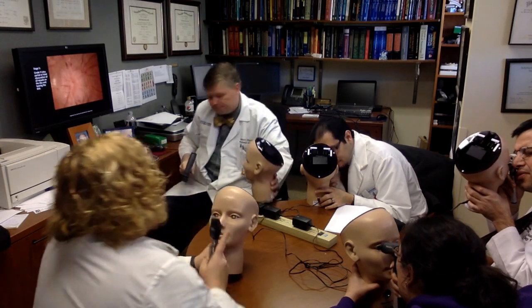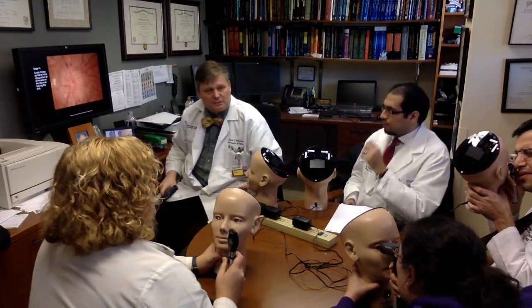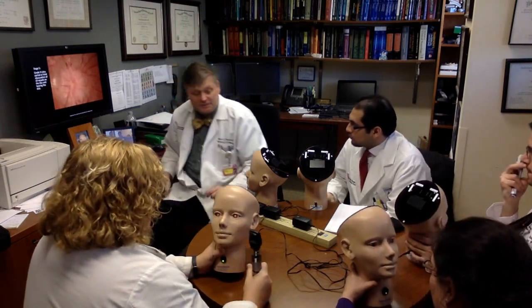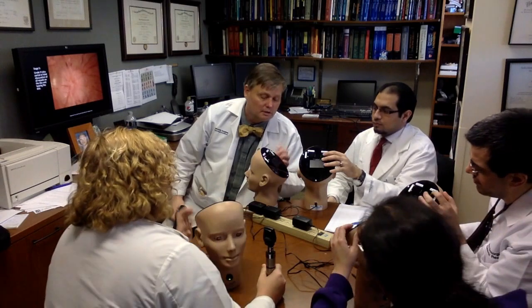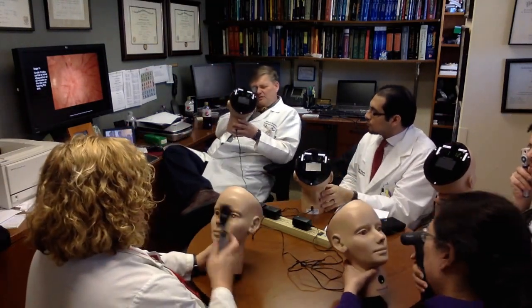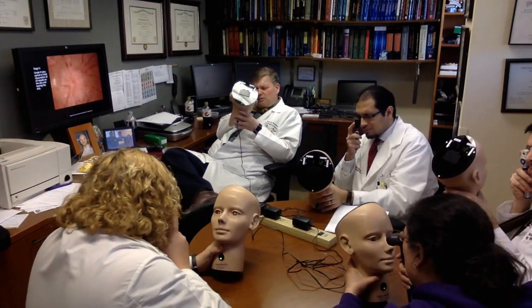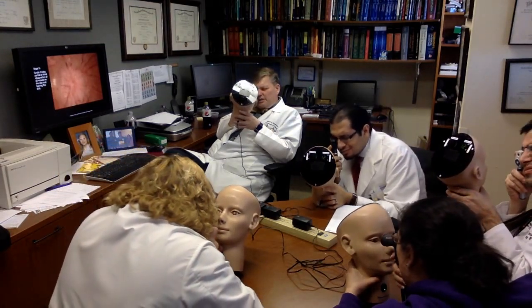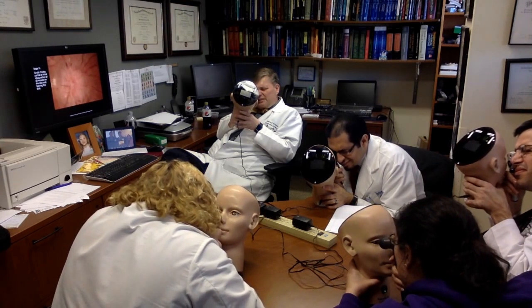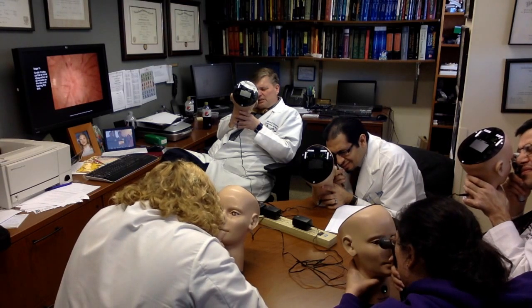Okay, good. What's the stage of this one? This one's probably 3. Yeah. Okay, good. Now let's turn to number 12. Number 12, same story. Let's look at a distance. Coming at 15 degrees. This one has more than one problem, but I want you to come in until you can kind of see the disc and then focus in on the disc.